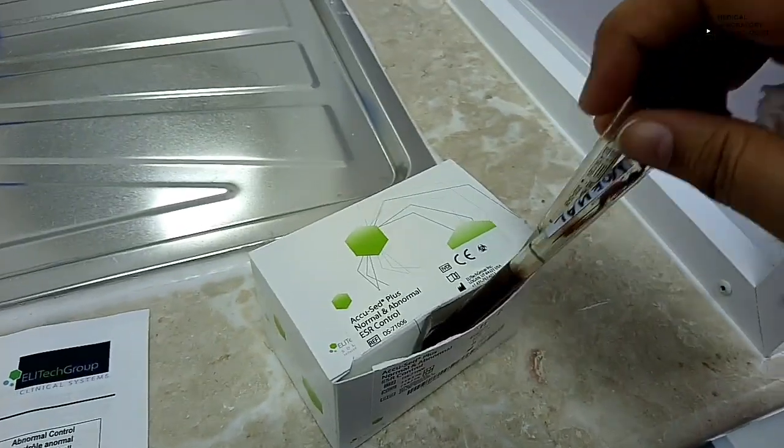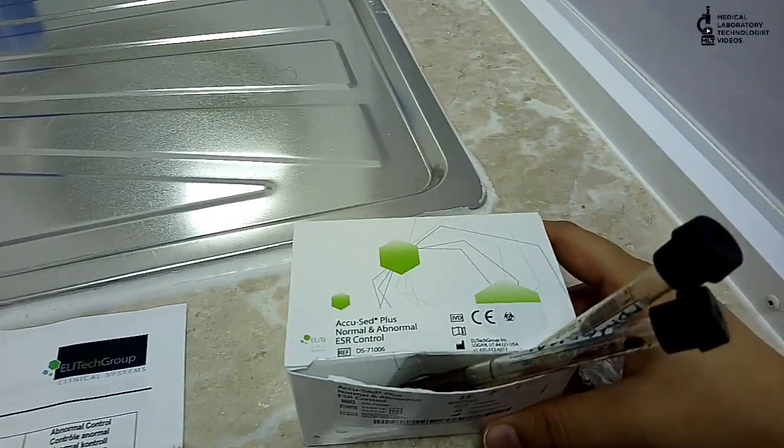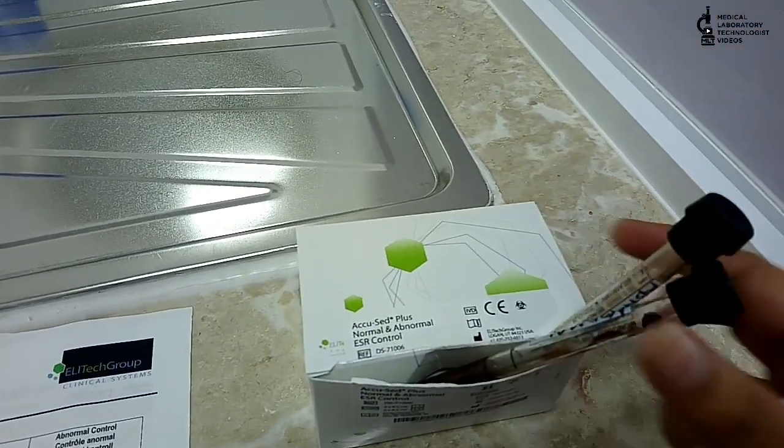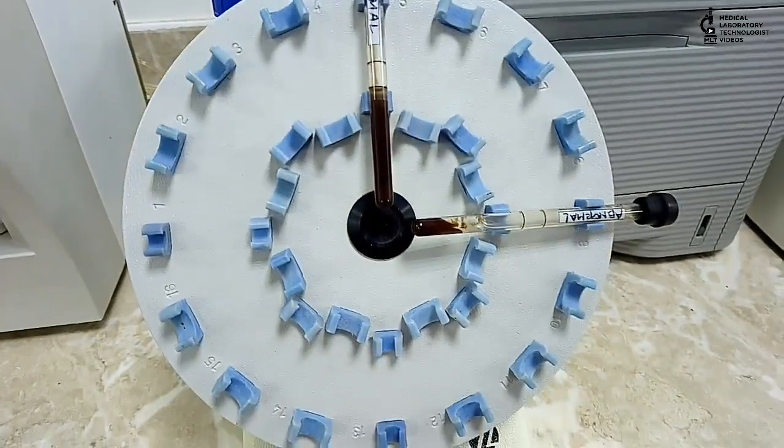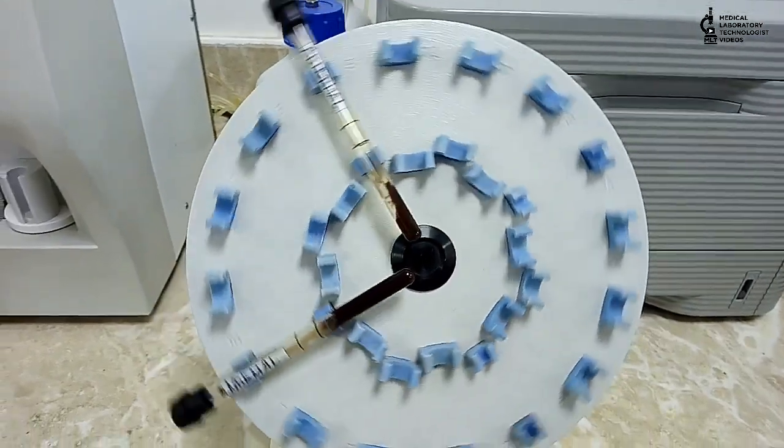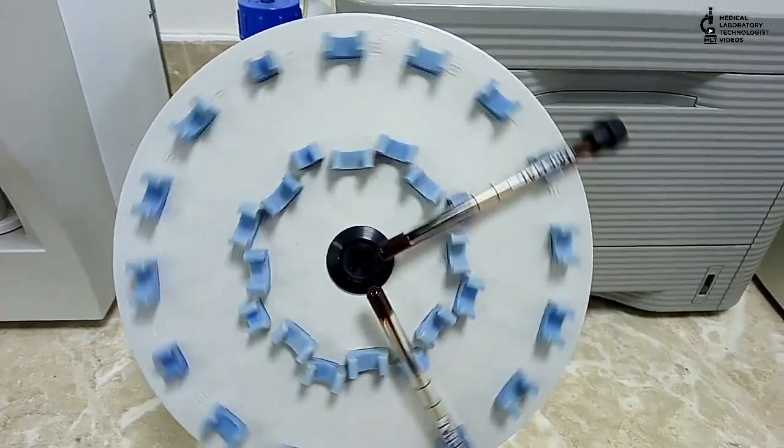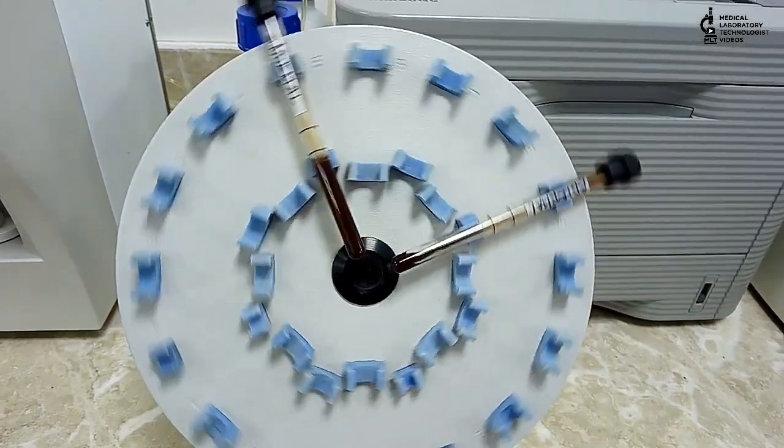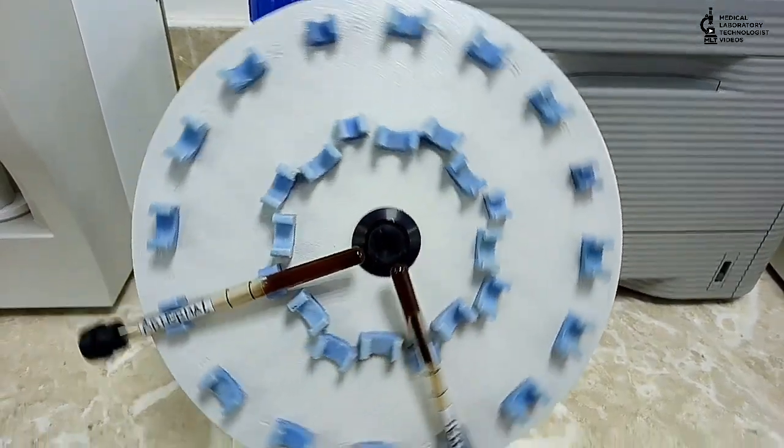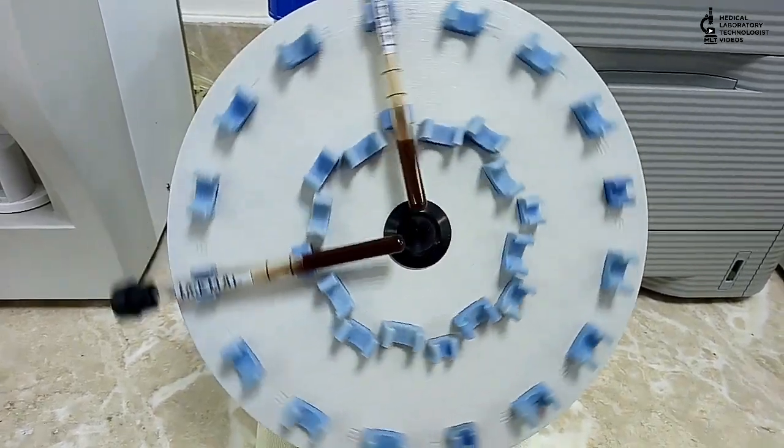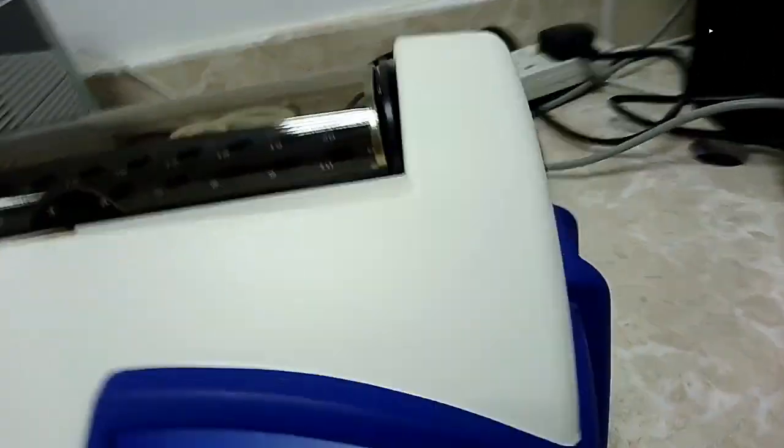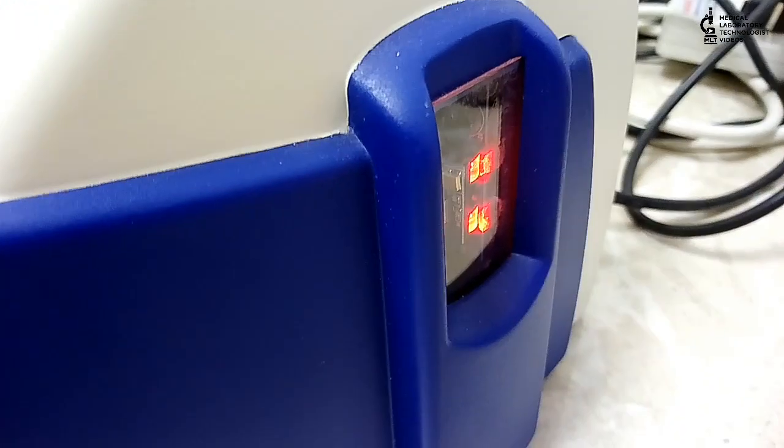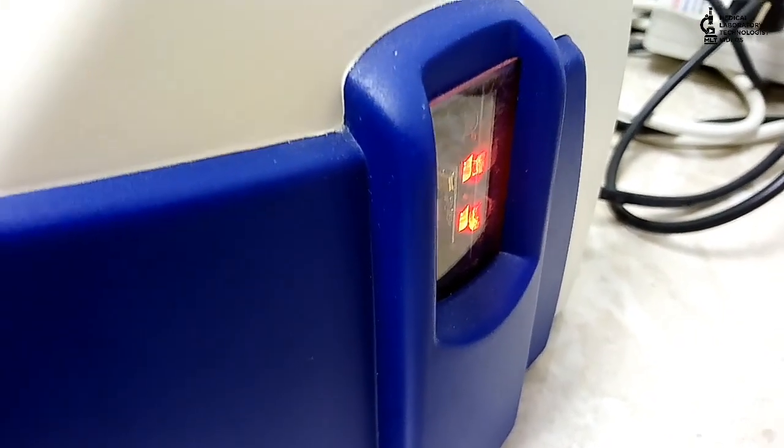This is a CBC rotor for CBC sampling. We use it for hematology samples for mixing. The same rotor you can use to keep normal and abnormal control and mix them properly. When you feel that your control is properly mixed, then you can use the barcode reader for this machine.